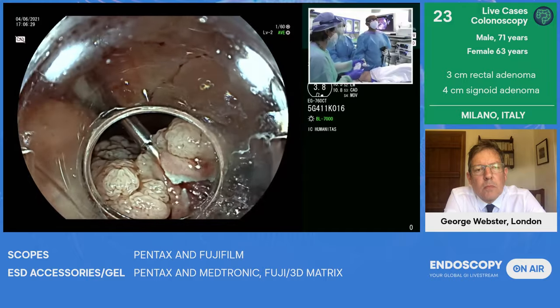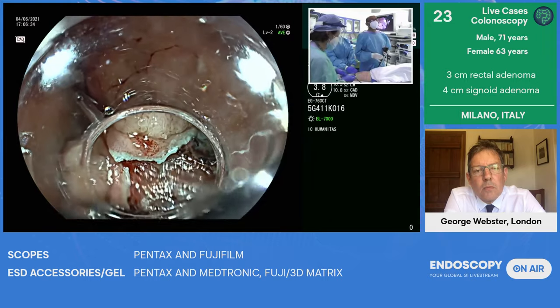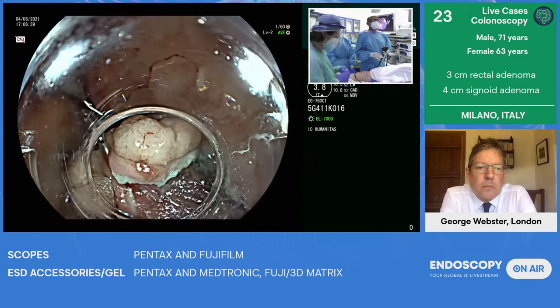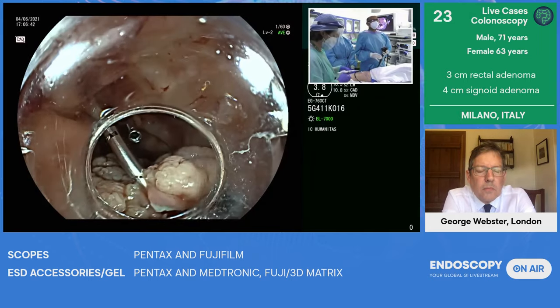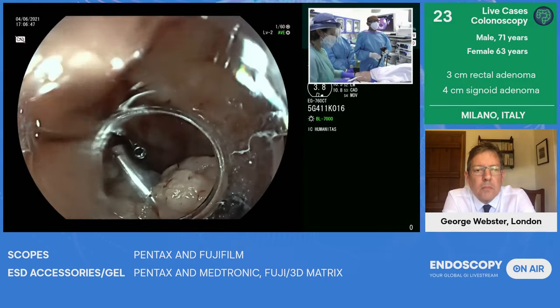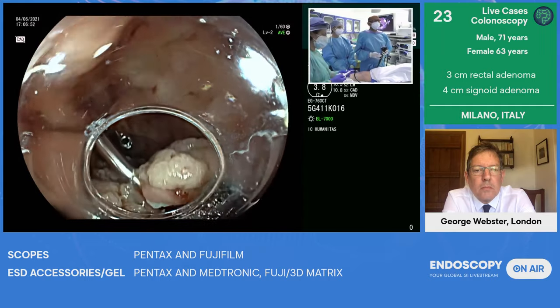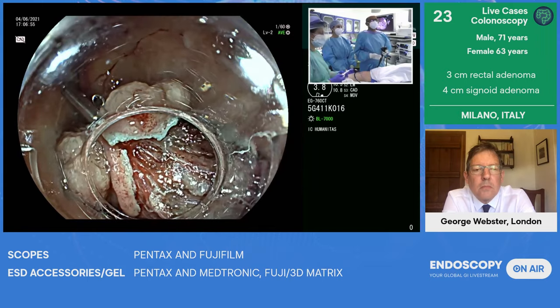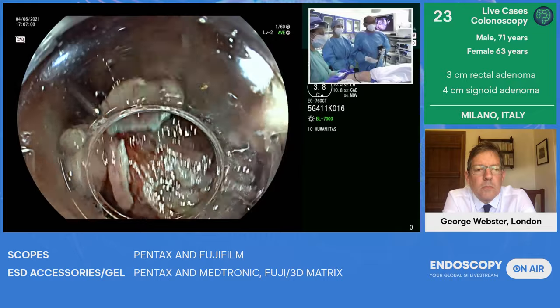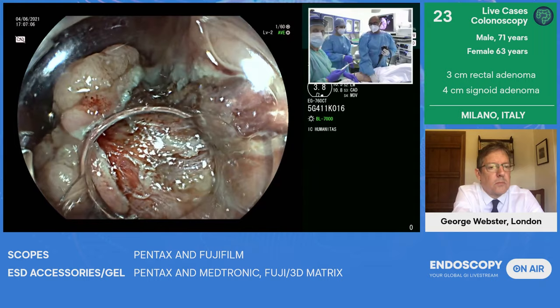As I dissect more, we get more and more traction. And hopefully more and more planes will open up. But the planes here are slightly muddied because of all the bleeding. As I said, in rectum, our biggest enemy is bleeding, and we encountered a hell of a lot of vessels, which is not uncommon in these low rectal polyps. Okay, knife out, please. Just the needle type. So this is that knife which converts into needle type or the ball type by just a switch of settings. So if you hold the scope for me just for a second.